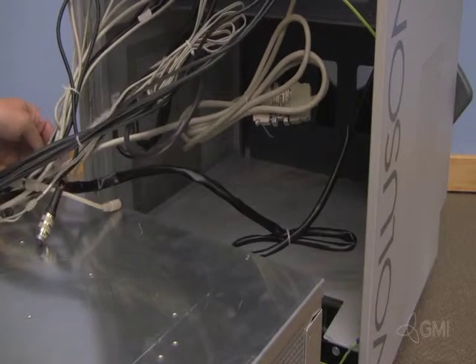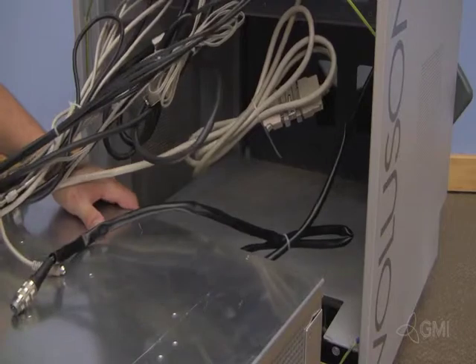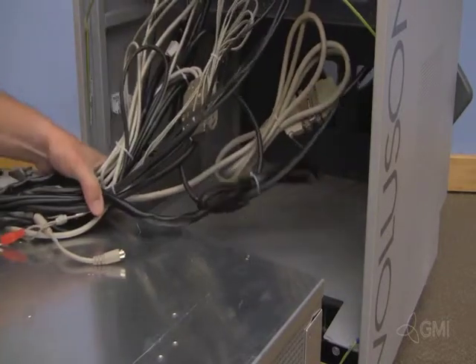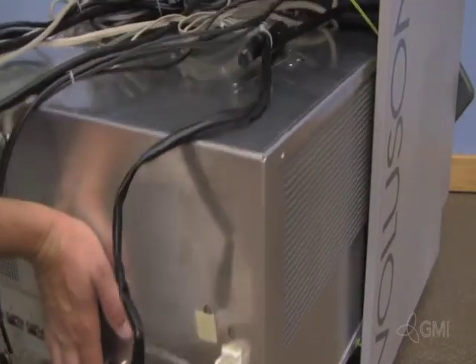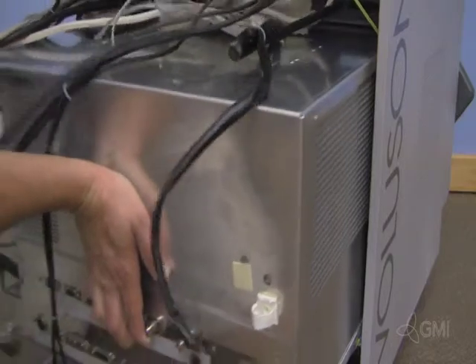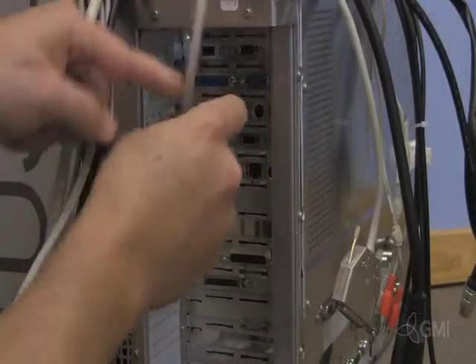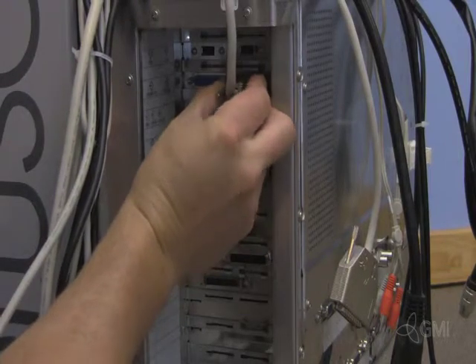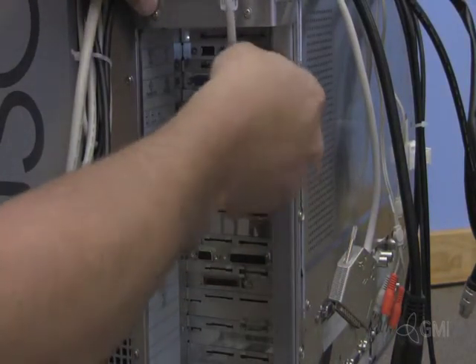Reinstall the e-box into the chassis. Hold the cables out of the way and make sure to leave the e-box out about 8 inches. Plug in all cables to the BEP. Make sure USB cables are plugged into the correct ports.